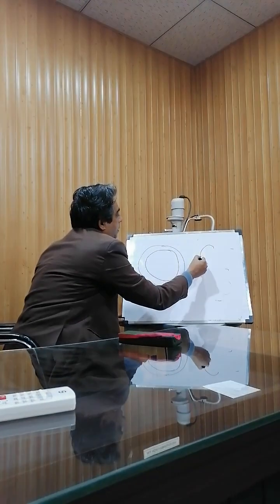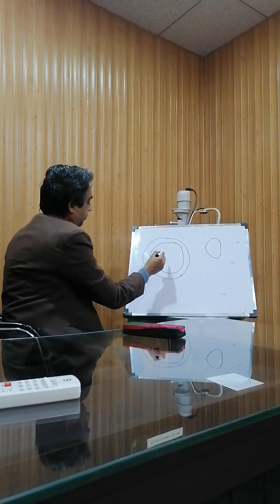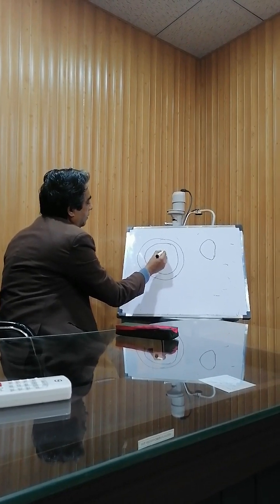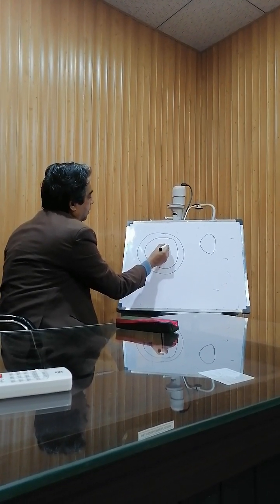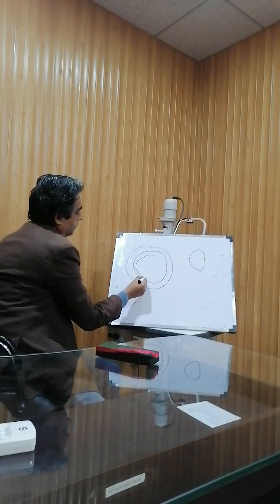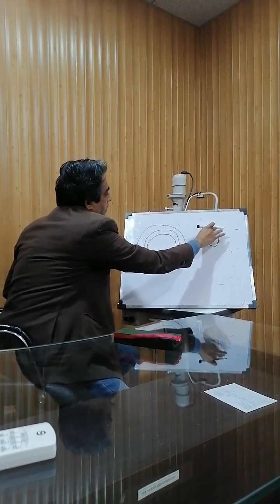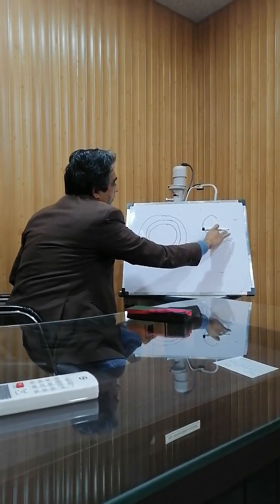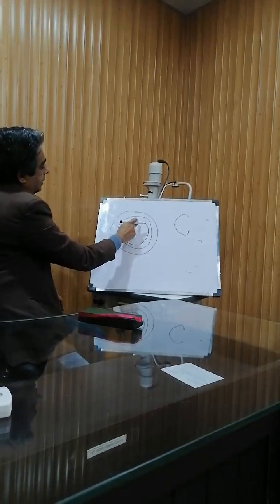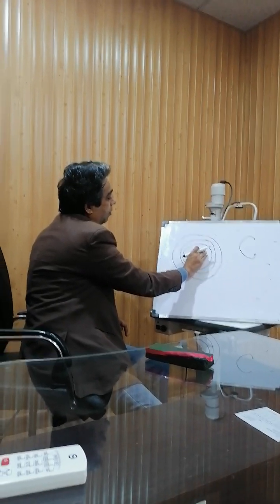This is the anterior capsule. We will remove it, but not in that manner. We will remove it like this, after putting the gel. It will give the same view, but you see, this is the capsule, and this is the anterior capsule removed. It needs a lot of practice.